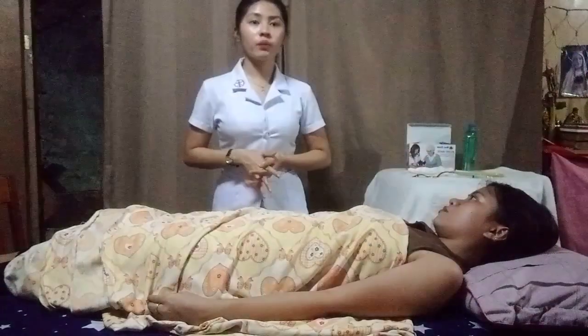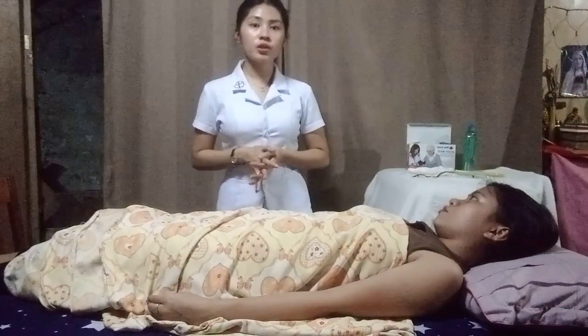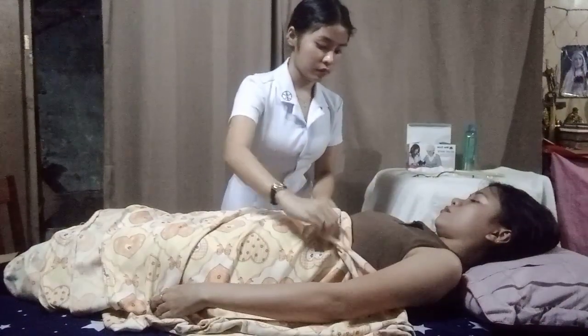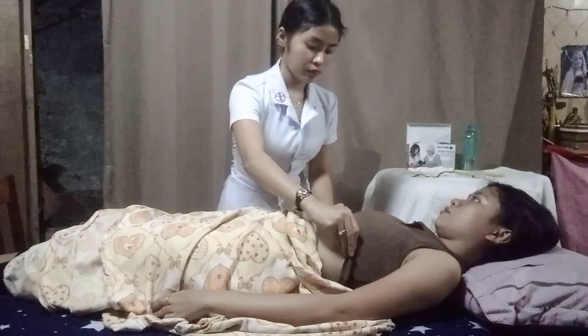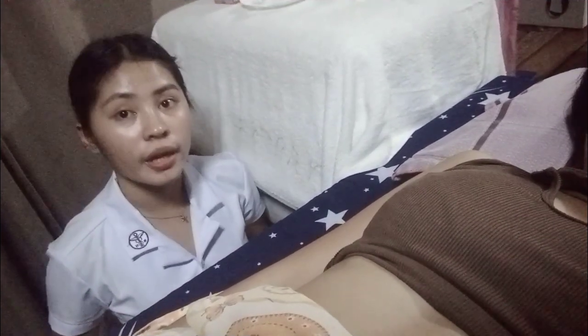Now, observe which site would be used and expose the potential injection sites. Now, inspect the area for any bruising, inflammation, or edema.